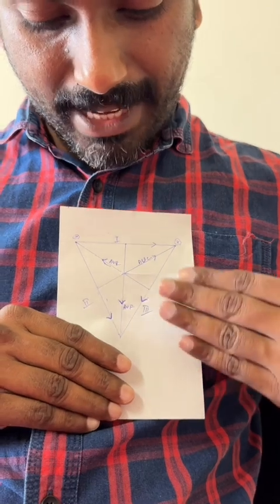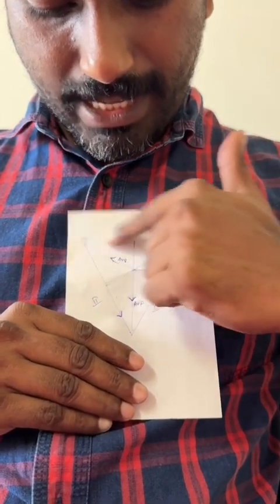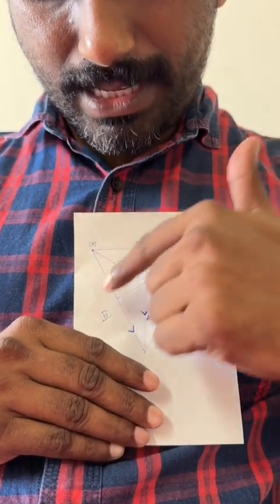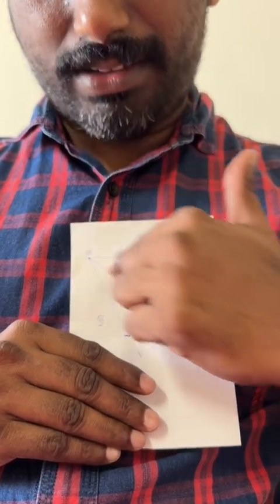So then what about extreme right axis deviation? In the extreme right axis, the heart will be in this direction now. So in lead 1 and 2, it will be the opposite direction. So we have a negative deflection in 1 and 2, and we have a positive deflection in AVR. Now you tell me about the causes of extreme right axis deviation.